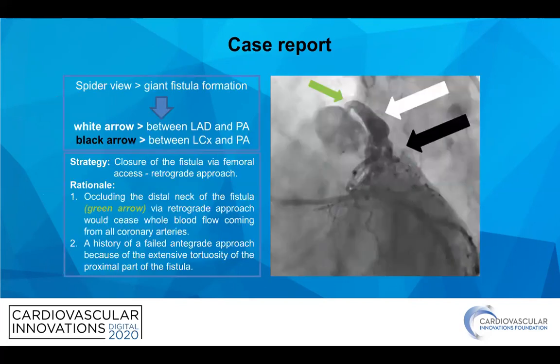In the spider view you can appreciate the giant fistula formation. The white arrow in this slide shows the large connection between the LAD and the pulmonary artery, and the black arrow demonstrates the communications between the left circumflex and the pulmonary artery.